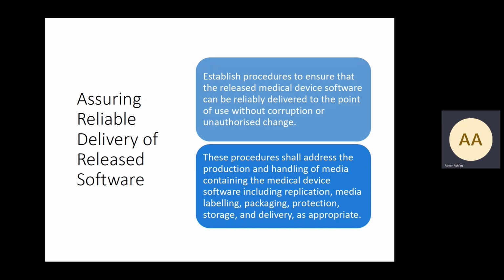So, assuring reliable delivery of release software. You should have a procedure also in your quality management system, which ensures that released medical device software can be reliably delivered to the point of use without corruption or unauthorized change. And this is normal in any medical device industry, hardware or software, where you should have some kind of final inspection or final acceptance inspection.